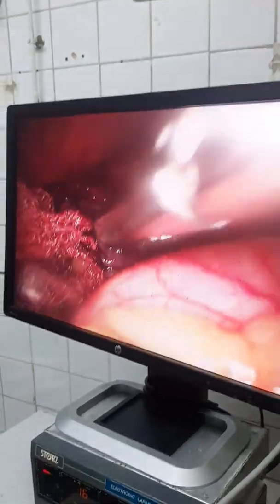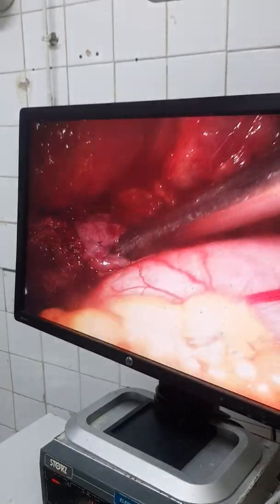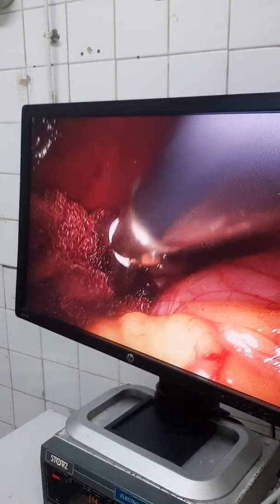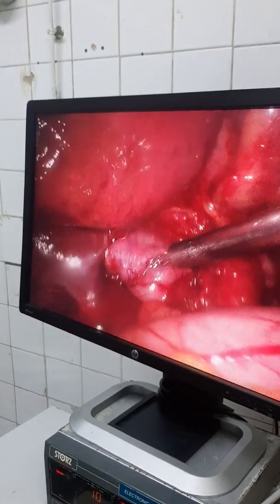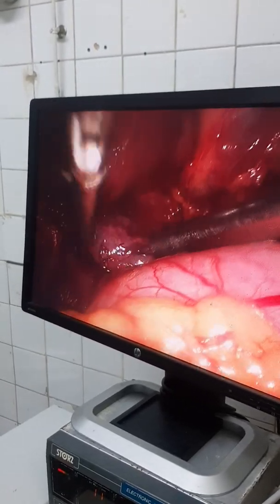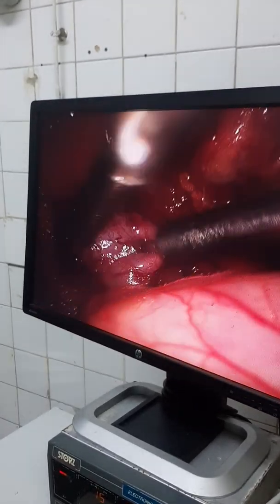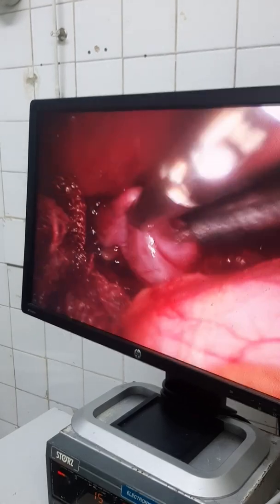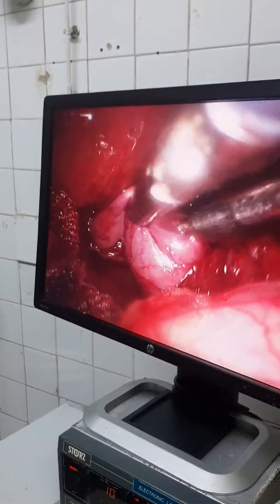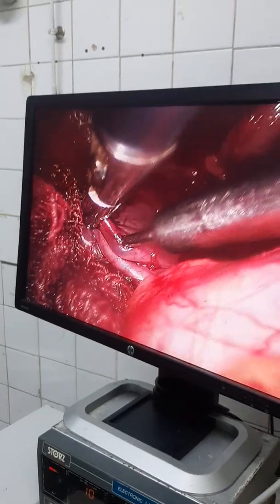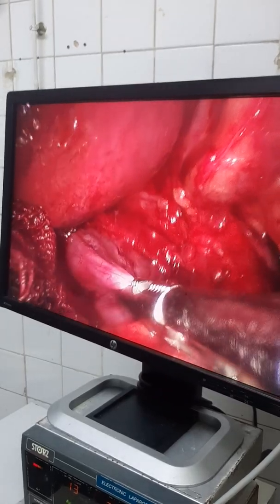Close. Push, push, push. Yes, I am holding the cyst now, completely holding the cyst now. Still doing suction of the cyst. Thank you.